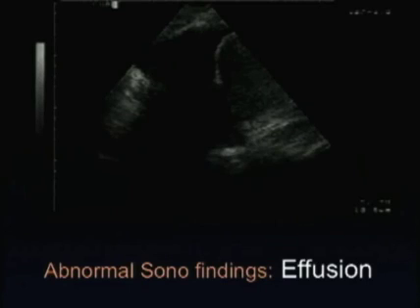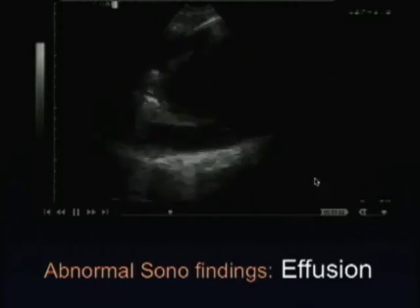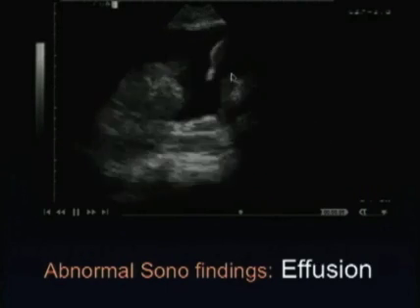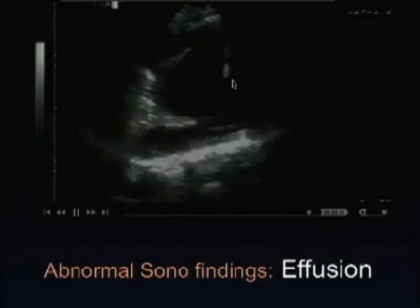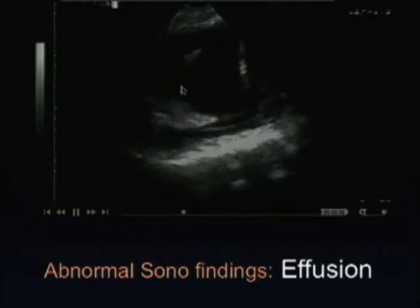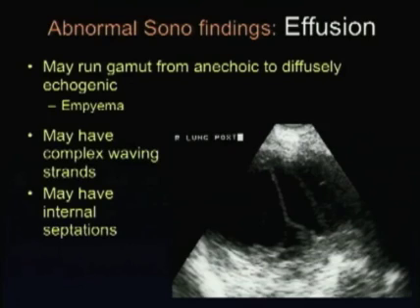Here's another effusion to be seen on ultrasound, and again we're seeing it's likely the liver here, I think. Again, might be the left side with spleen, I'm not sure. Diaphragm, lung, very atelectatic, floating in the effusion.